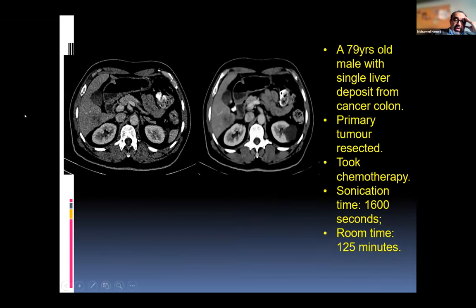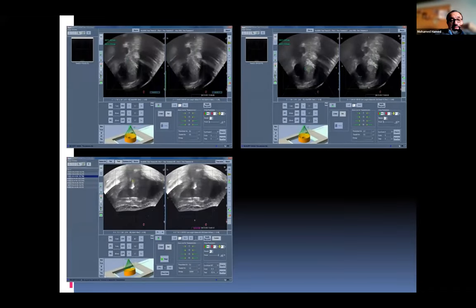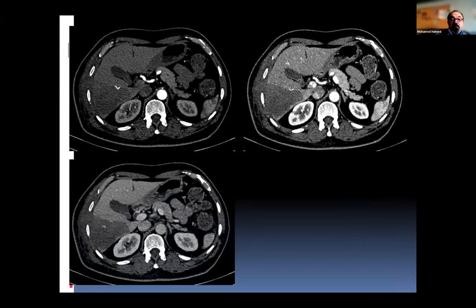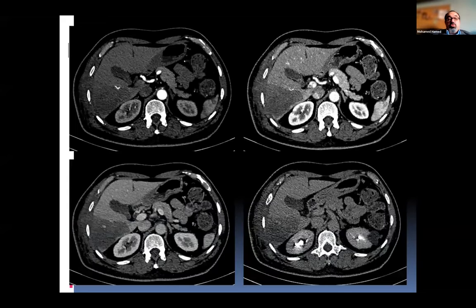Also, I show you this case with a metastatic lesion insinuated between the bowel and the liver surface. And after HIFU, a very simple case, you can see a wedge-shaped ablation. This is also a very good indication that the HIFU is strong. And sometimes you can't see the infiltration of the tumor, but the HIFU is spread throughout the infiltrated area, and this is good also. Sometimes we do HIFU, and if the lesion is responding to the ablation, that means it's not normal hepatic tissue.